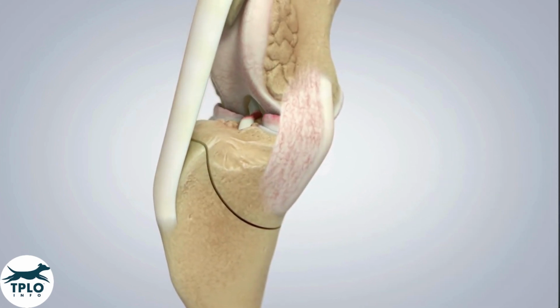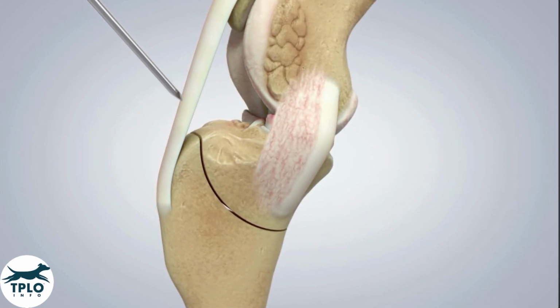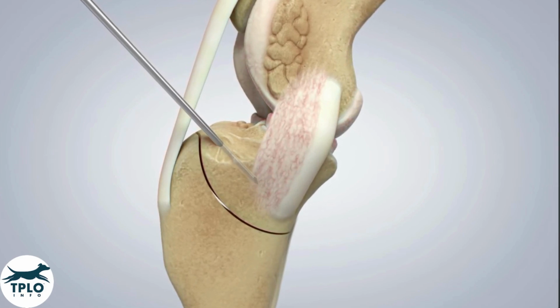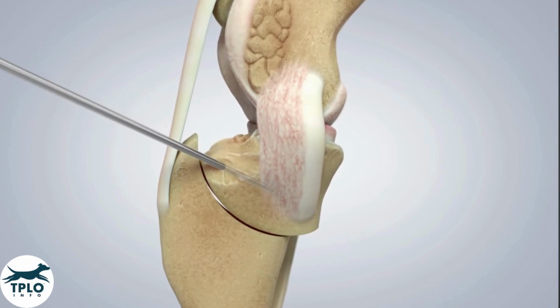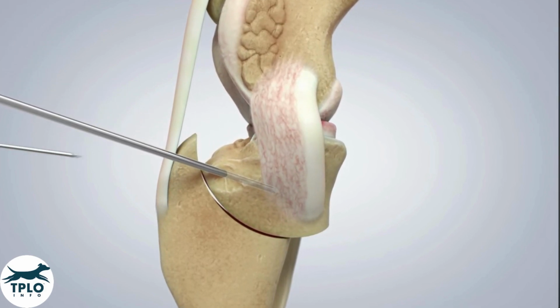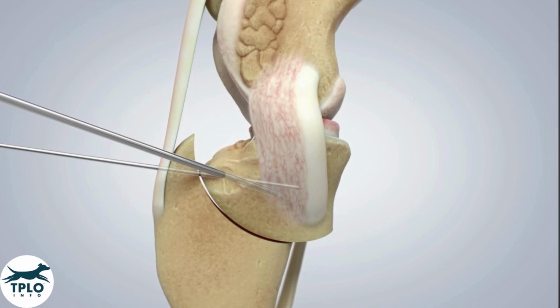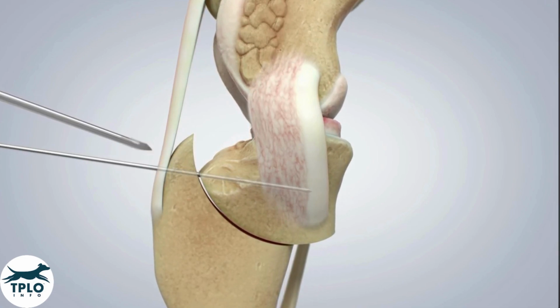Next, a stainless steel pin is inserted in the proximal osteotomy segment and used to leverage the proximal segment until the desired tibial plateau slope is achieved. After that, a second pin is passed through both segments to stabilize this new position for bone plate placement.